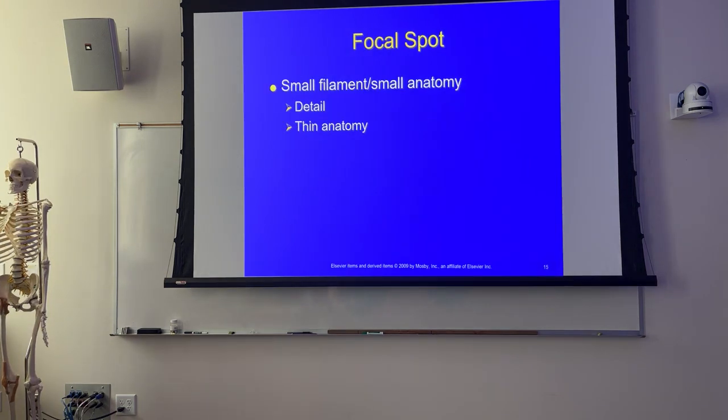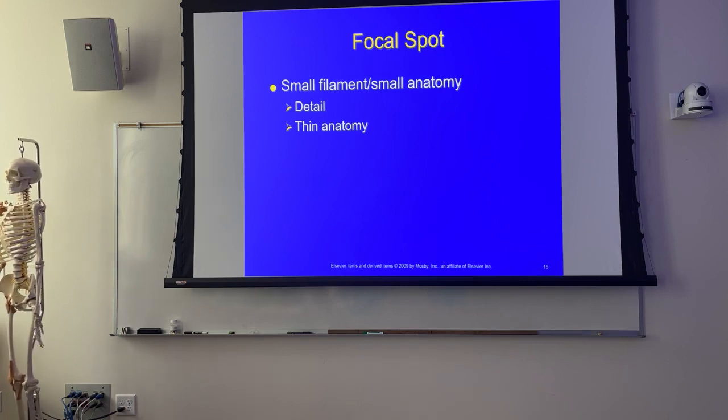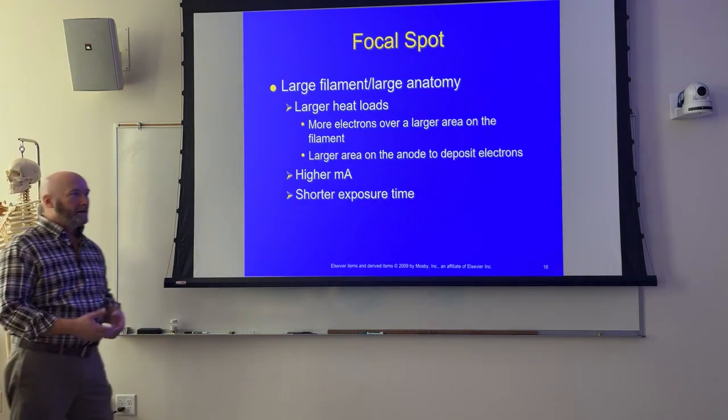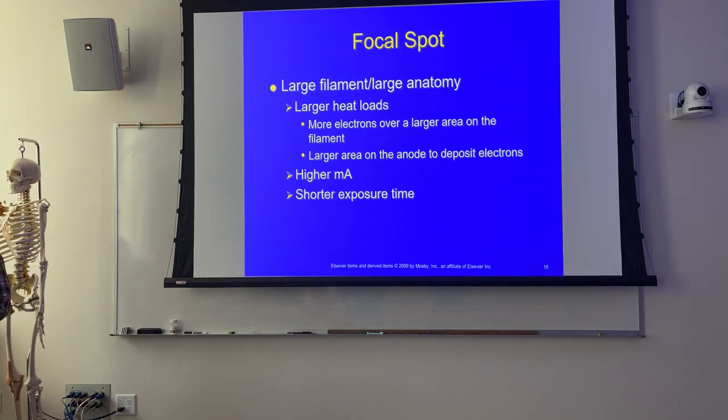Okay? So focal spot, we talked about that. Small filament, small anatomy. That's when we're looking at detail. Thin anatomy, where we're going to have limited exposure. Larger focal spot, where detail's not as important, where we need high exposure, the X-ray tube can take a higher heat load.